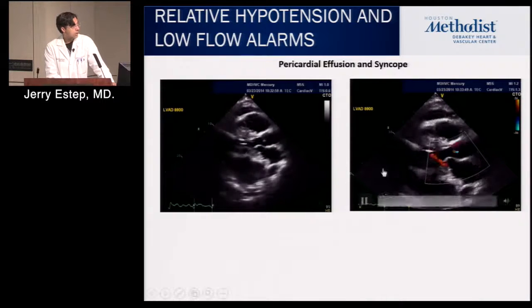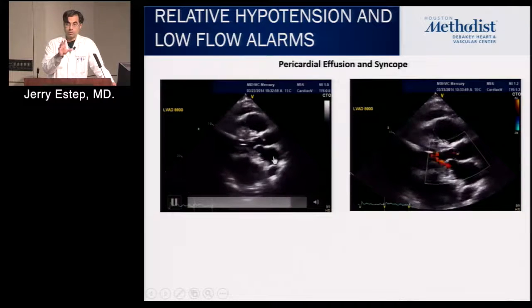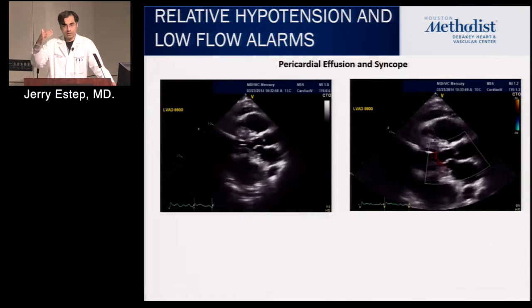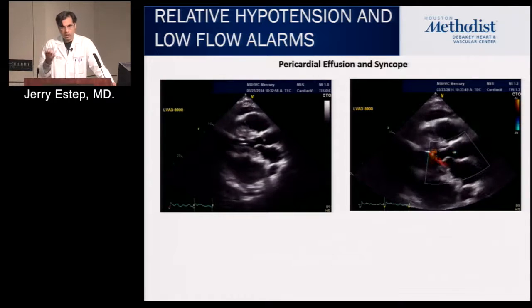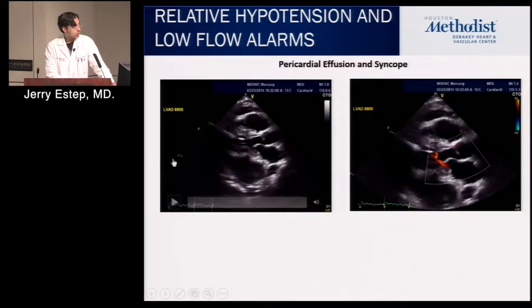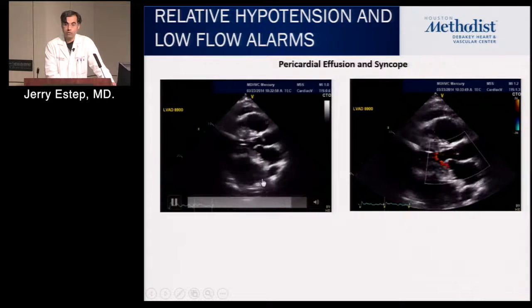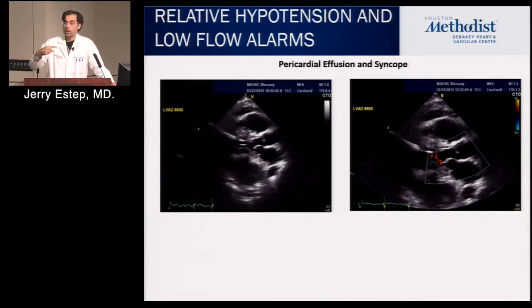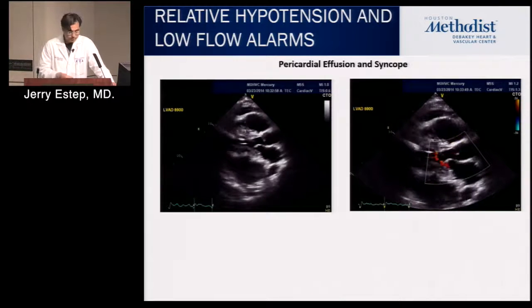So echo can be very useful. Now you have a Swan-Ganz and you have hemodynamics. Remember, low blood pressure, high CVP, the console can help you in the setting of alarm troubleshooting, but both scenarios would have low flow alarms. So the echo can really tease out the best next step, in terms of the surgeon opening up the chest, anticipating draining the effusion or opening the chest to help minimize RV failure.